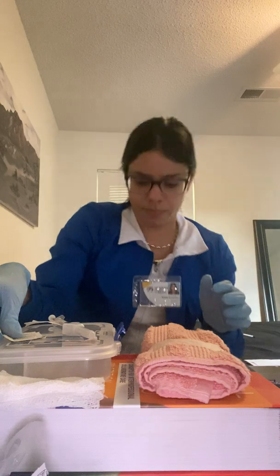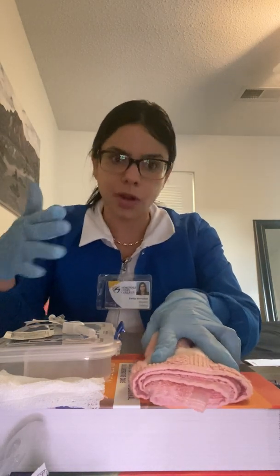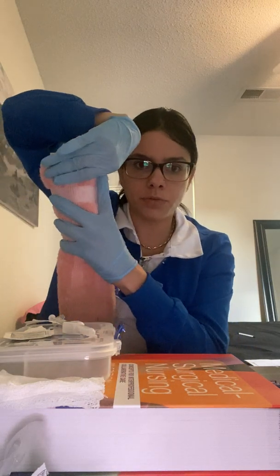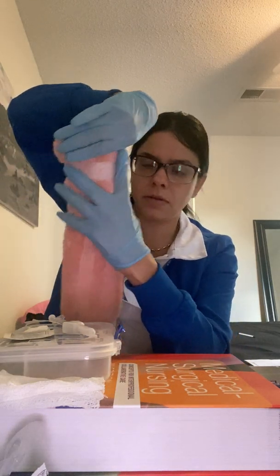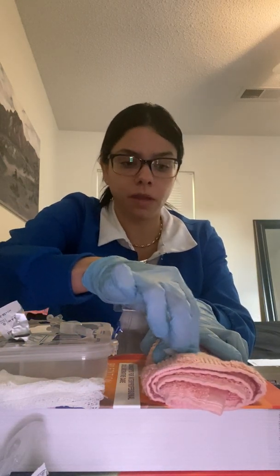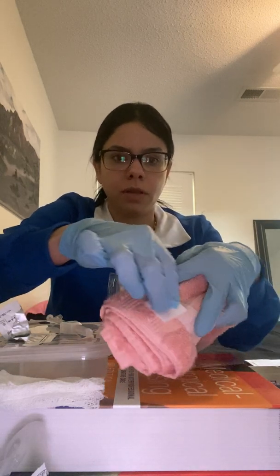Okay, so what I'm going to do, it's hard when it's not a real arm. So like I said, it's somewhere in between, maybe where the tape is, right there. So I am going to open my alcohol pad, and I'm going to start cleaning the area, doing a circular motion going outward like this.